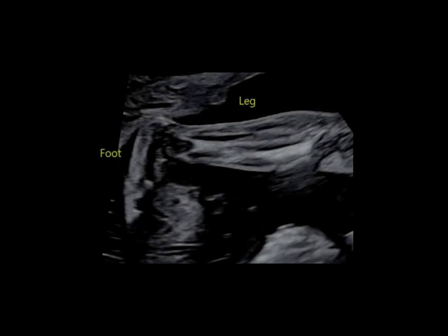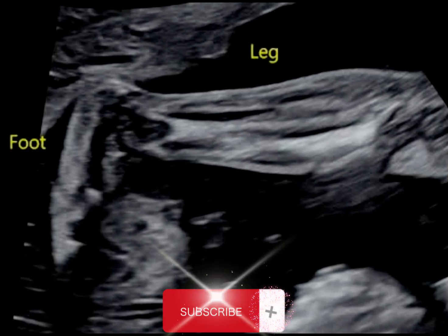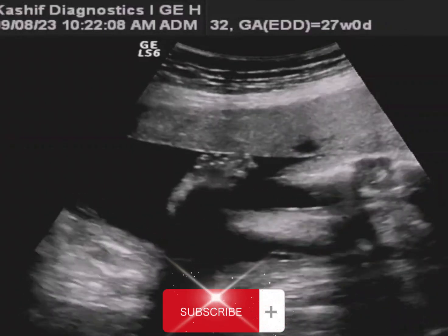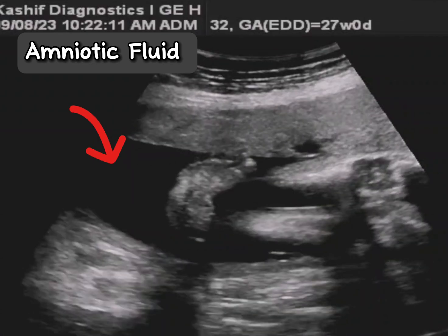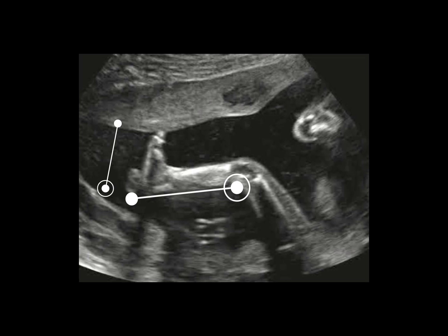There are many limitations in ultrasound scanning. In most cases, the feet are resting along the uterine wall, which gives a false diagnosis of club feet. There must be sufficient amniotic fluid around the fetal feet, and the ultrasound probe should not be angulated.